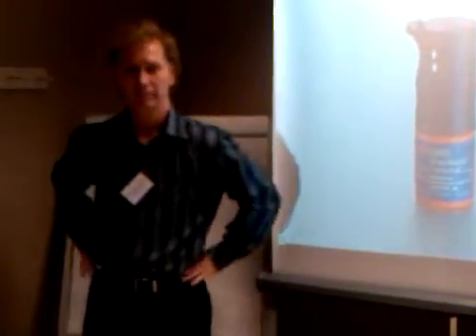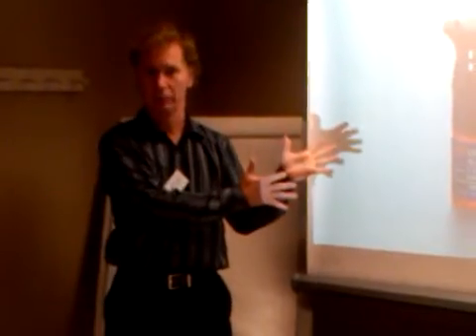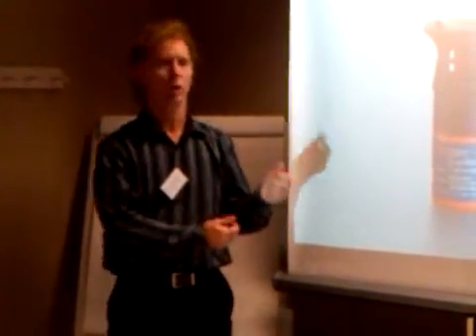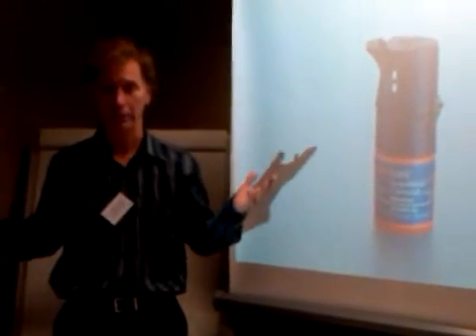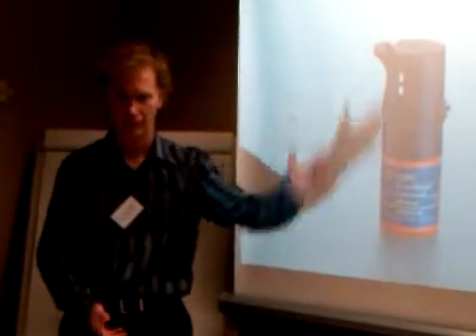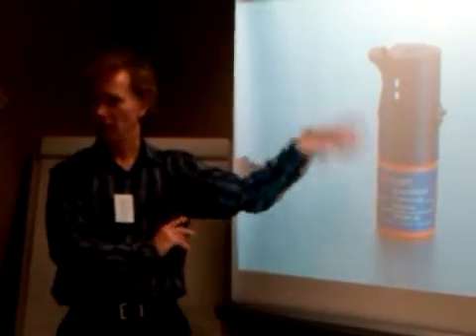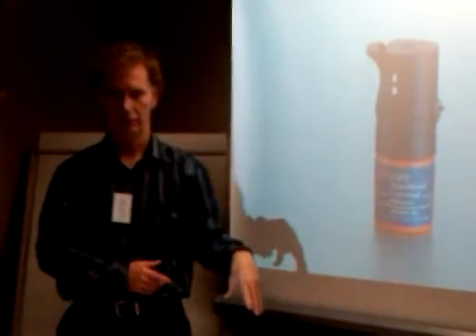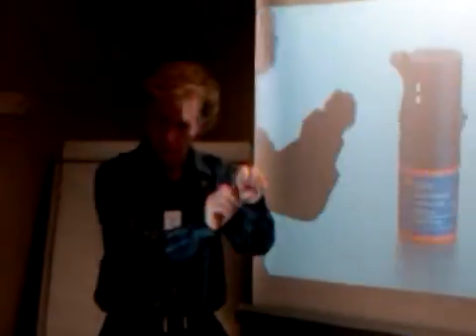How frequently do you use it in conjunction with blue etch? I always etch the enamel with blue etch, or what we call rinse etch. They say, why are you using a self-etching resin if you're doing total etch, David? Because this has a fabulous dentin bond, and in cases where I've got no enamel, like a crown buildup, I'm not going to etch it with blue etch. I'm just going to go straight to self-etch. If I use rinse etch, it's fine. If I don't use rinse etch, it's fine. Either way, I want to agitate it for 20 seconds to get a good permeation of the dentin tubules and to reduce sensitivity.